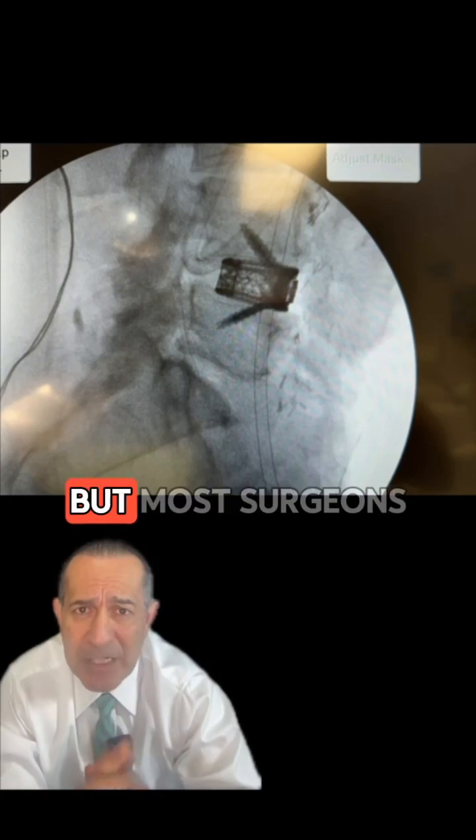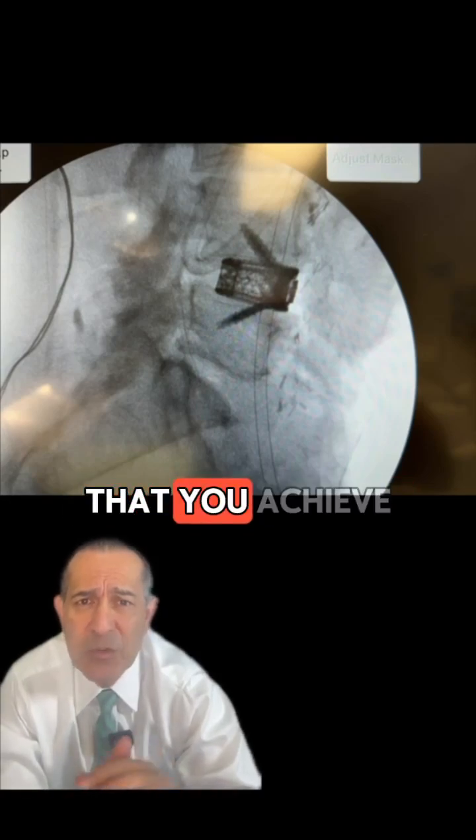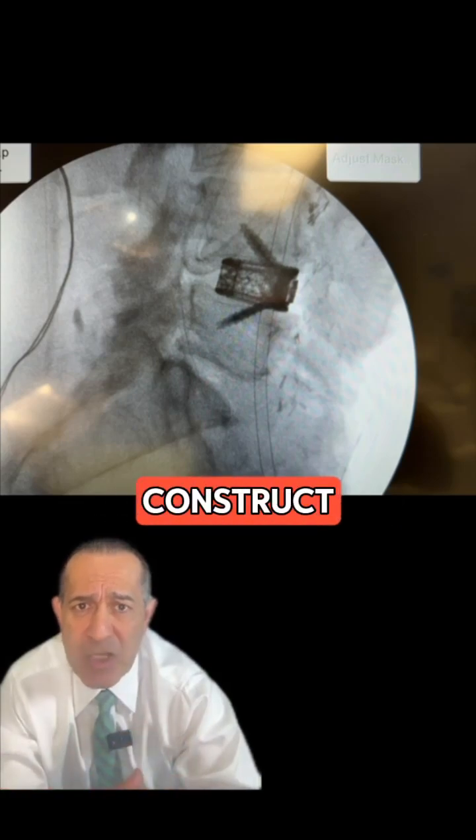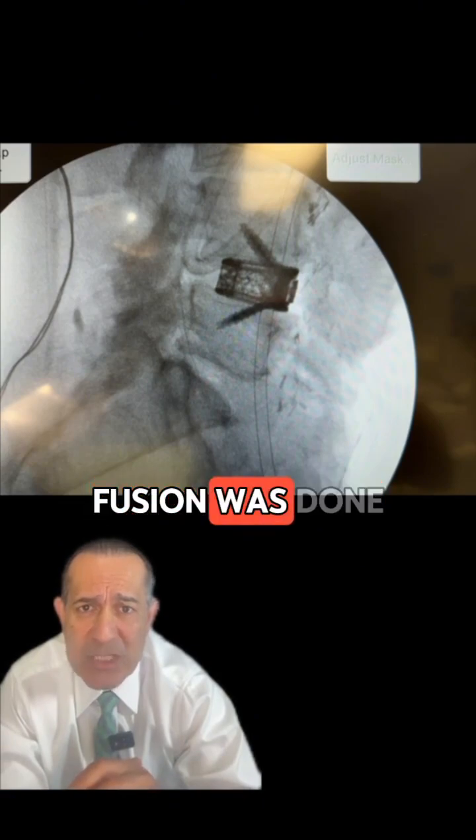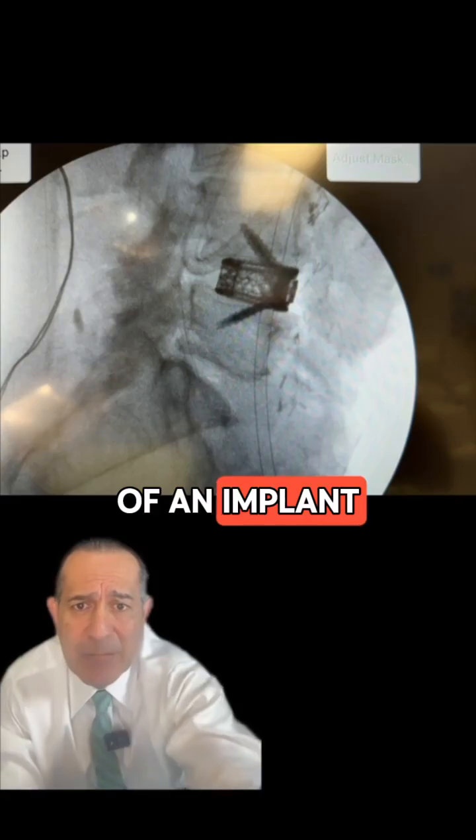You can potentially leave this cage by itself and not supplement it with pedicle screws, but most surgeons would agree that you achieve a more stable construct when you put pedicle screws in the back after the front fusion was done with this type of implant.